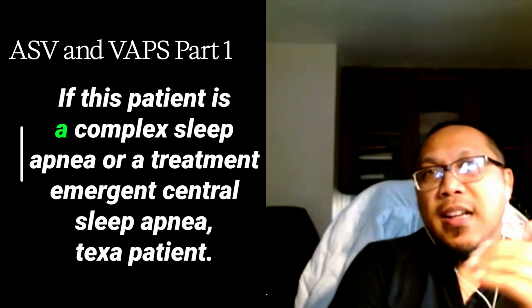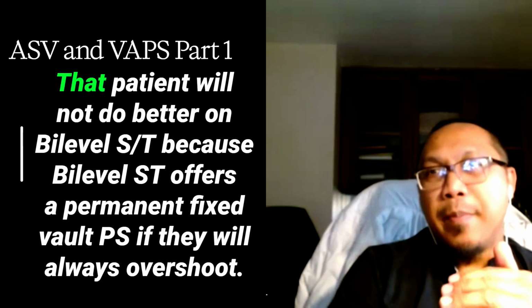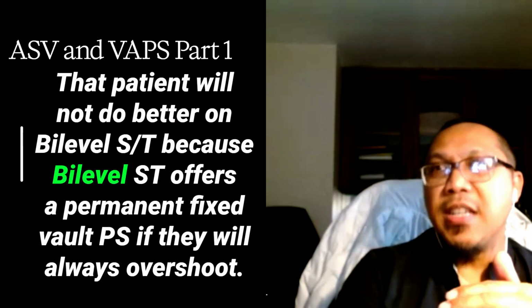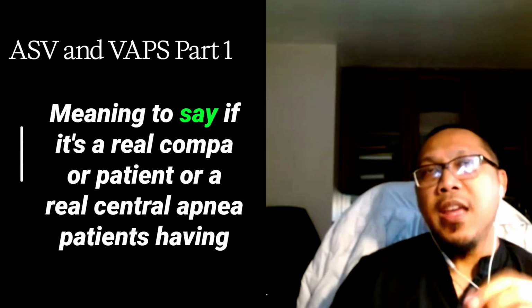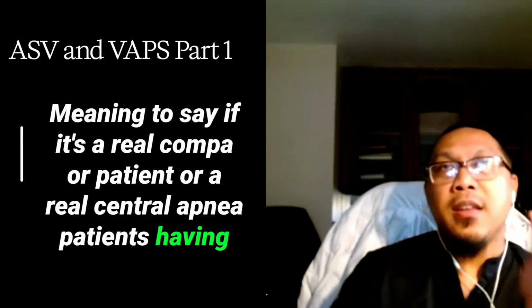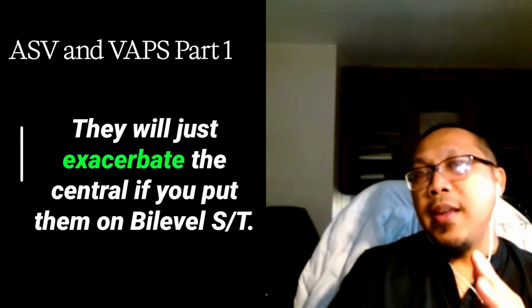If this patient has complex sleep apnea or treatment-emergent central sleep apnea, TECSA, that patient will not do better on bi-level ST, because bi-level ST offers a permanent fixed pressure support, and they will always overshoot. Meaning to say, if it's a real complex sleep apnea or a real central apnea patient having more than 50% of their events as central events or central component, they will just exacerbate the central if you put them on bi-level ST. Okay?